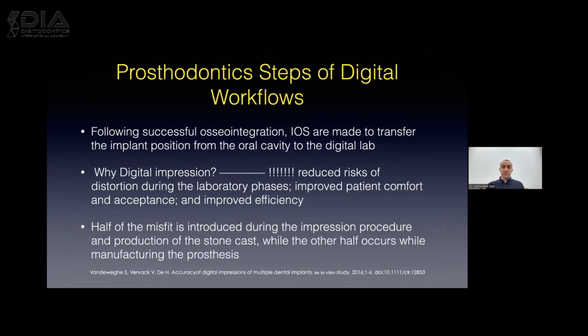So after placing the implant and the implant has osseointegrated, we will move to the prosthodontic step of the digital workflow. After successful osseointegration, we will start doing intraoral scanning for the implant to move the implant position from the oral cavity to the digital lab.